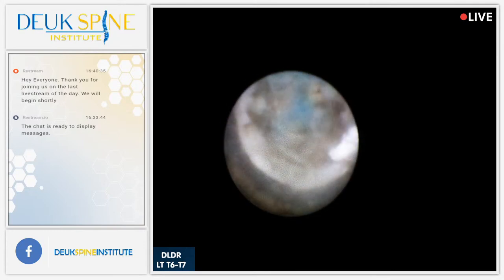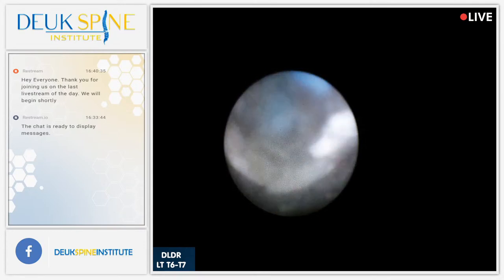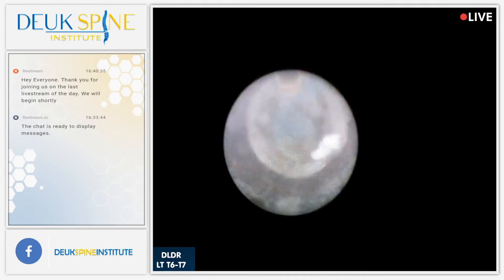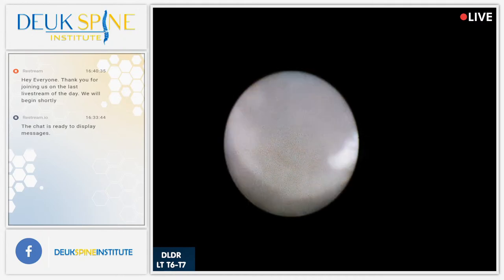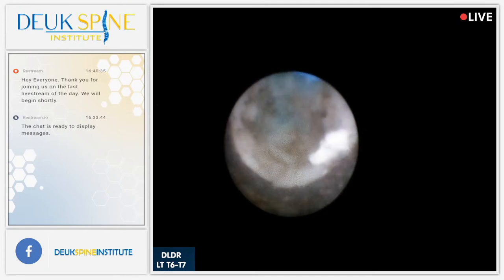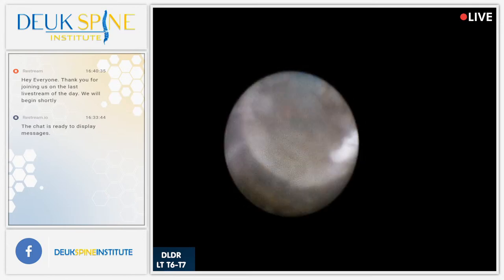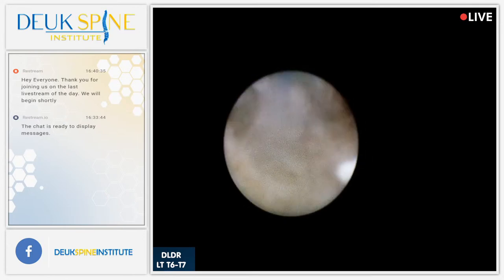There's a herniation right there. You guys see the blue? Everything blue is degenerated nucleus pulposus. It's the bad stuff, okay? That's what we want to remove. And we're working inside the annular tear, debriding the tear, so that it will heal on its own. Get rid of the pain.